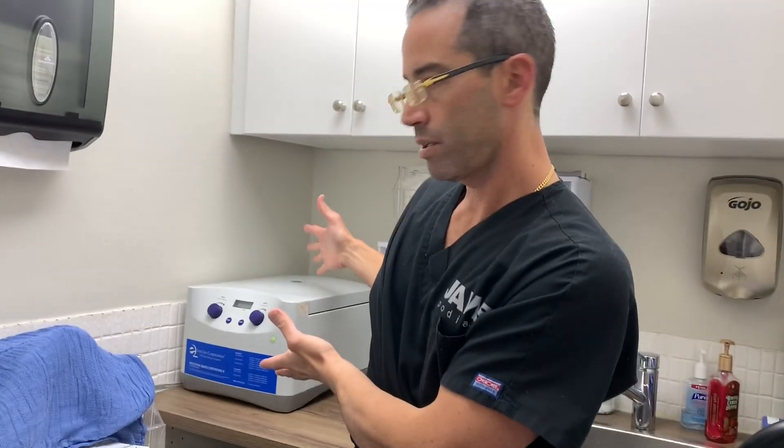So again, part one: we drew the blood. Part two, as we speak, that's exactly what we're doing — about 30 to 40 cc of whole blood. And then I'm going to explain to everyone, to the whole world, what are we going to treat?